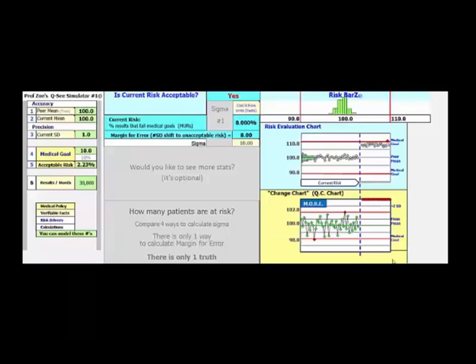So now you can see the final chart, the final visual, and this is the QC chart, or the change chart as I like to call it. The QC chart has the measured mean at the center, the current mean, and uses the current SD limits to set the plus and minus 2 SD that are shown here at the red lines. This is what you expect.